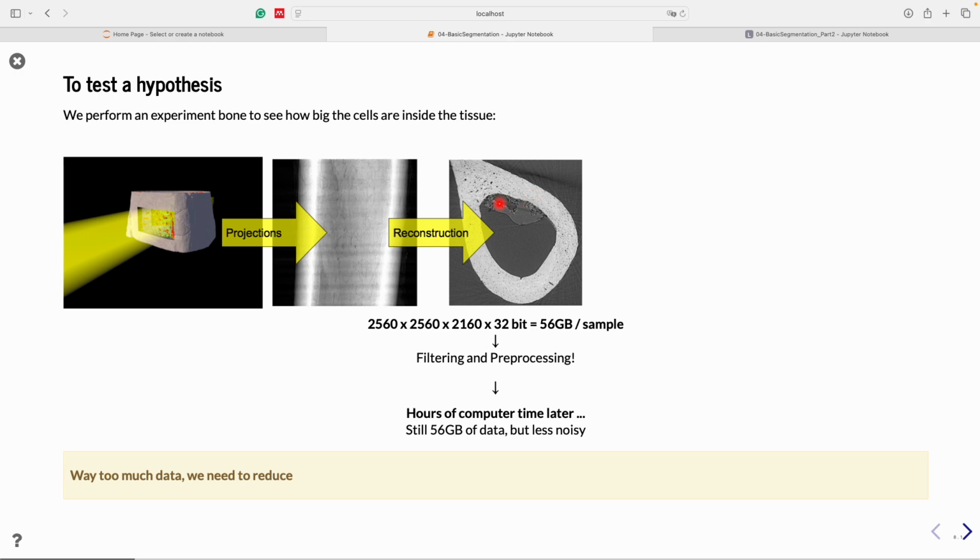I believe that is probably some marrow. And then you can do analysis on the shapes in here. Those shapes are not so easy to see actually in that one. You can see maybe there are these pores, like stripes in this projection, but it's more guessing than really telling.